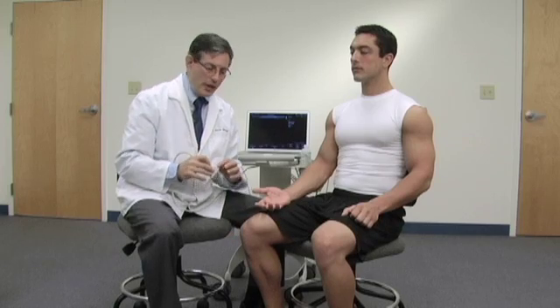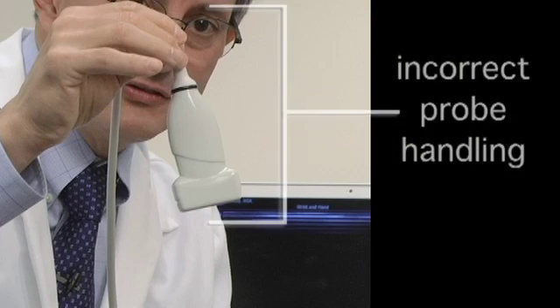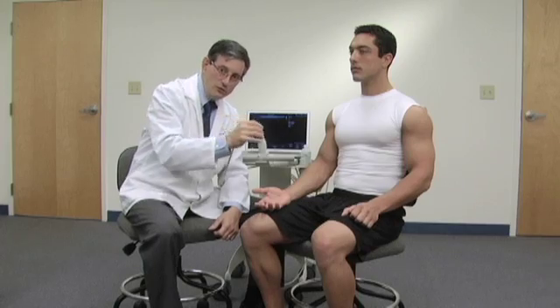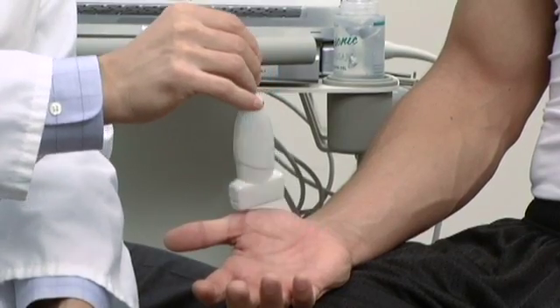In this first introductory video, I'd like to start with some very basic things. The first thing we're going to start with is how to hold the probe, because proper control of the probe is very important to obtaining a good image in ultrasound. In teaching this over the years, I've noticed that a lot of people like to hold the probe something like this. When you do that and you place the probe on the person, it's very likely to slide and slip around.